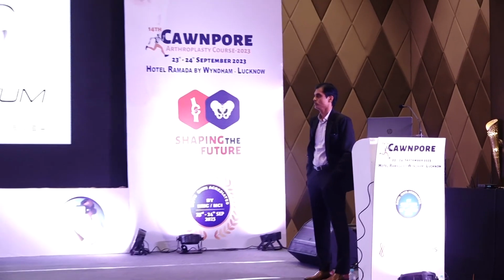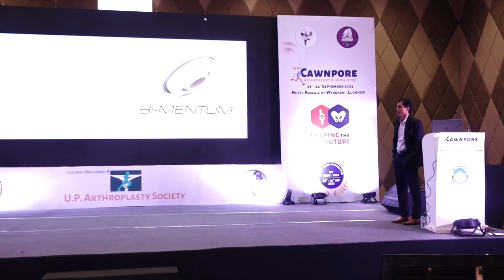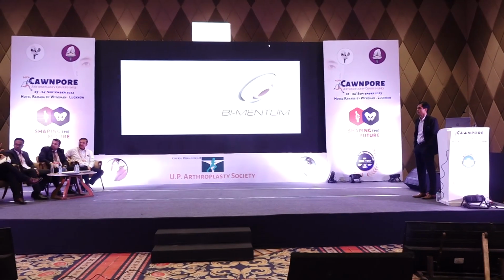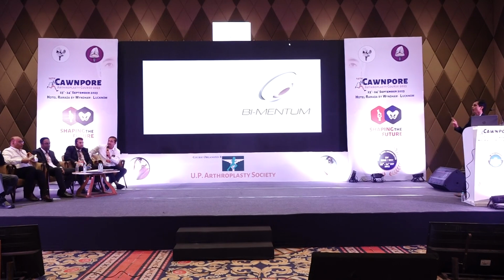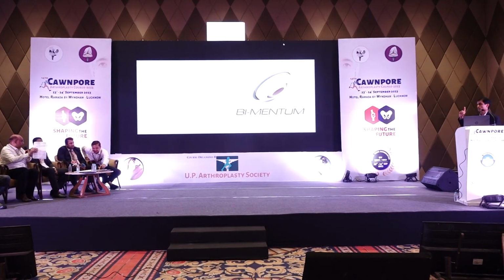where the protrusio is so much, and all the modular bipolars in our local market immediately become unipolar in a short duration of time, whereas these modular bipolars made exclusively for these kinds of situations work well. So the incidence of protrusio is very low. I'll answer that, and also add to that. If you have a fresh trochanteric fracture where you are putting an implant, bipolar is fine. But if you have a patient who has not been walking for 3 weeks, 4 weeks, 5 weeks, anything more than that, the cartilage of the acetabulum has also undergone necrosis. So those ones I think we should definitely go for a THR, not a bipolar. That was what I was saying. Modular bipolar I said in acute fractures. Yes, acute only. So that's what he was mentioning.